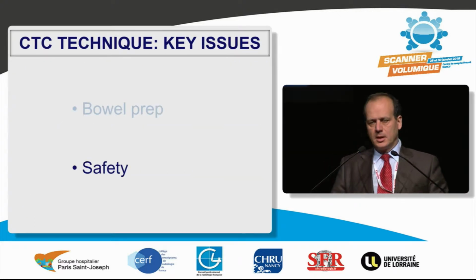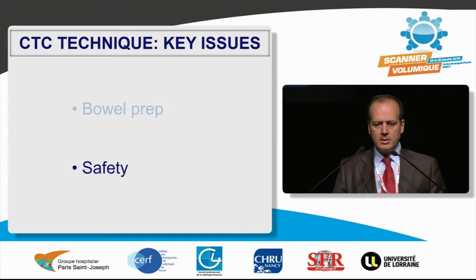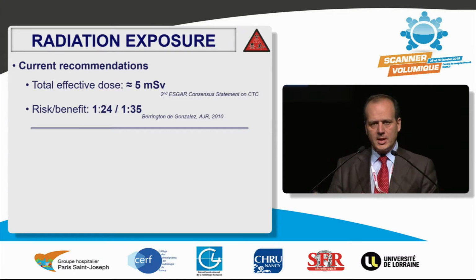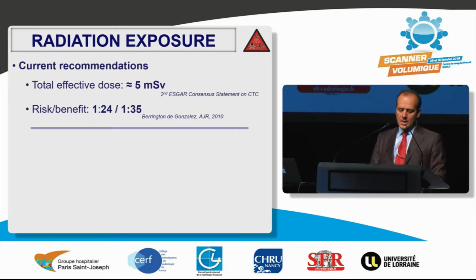The other important difference compared with the images back in 2000 is radiation exposure. You know that radiation exposure was one of the sources of major concern from the gastroenterologists. Most of the critical issues they raised in their papers were about the radiation exposure.